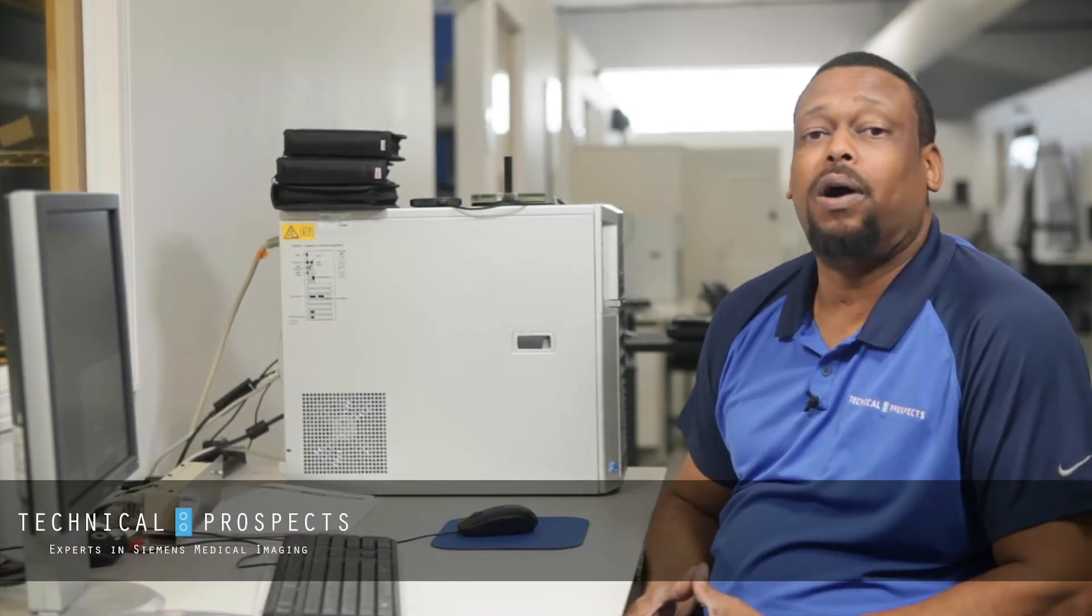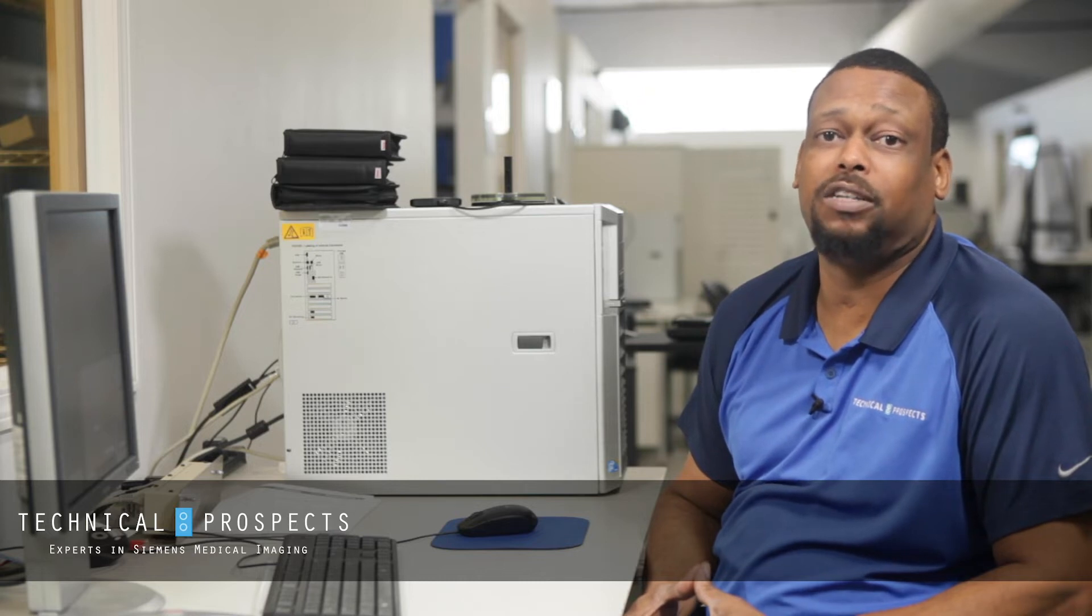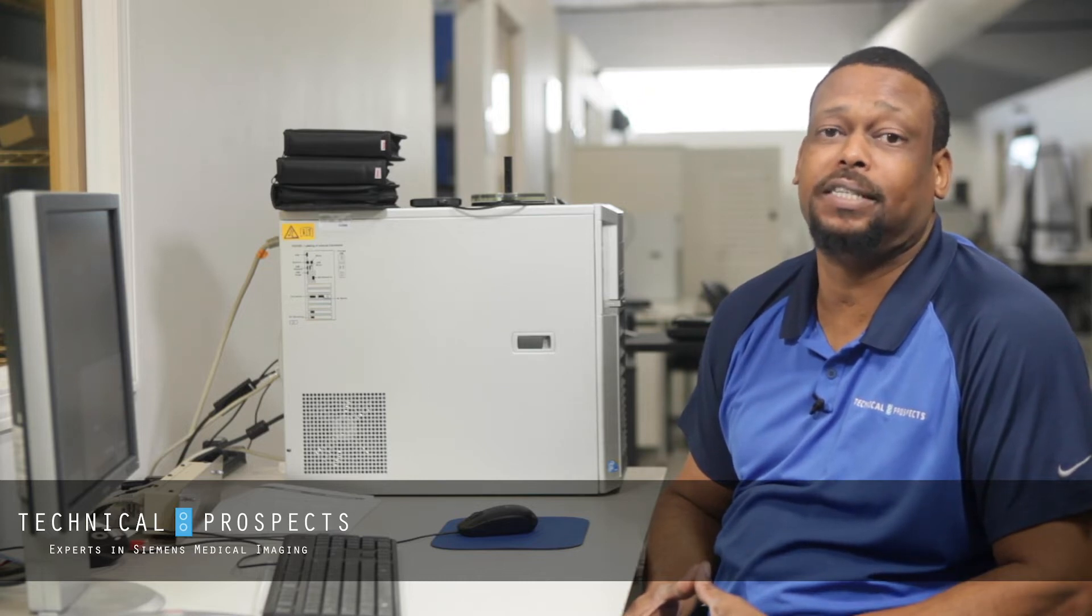Hi, this is Joe with Technical Prospects coming to you again with another Tech Tip. Today we'll be discussing how to access and save your files for your tube history on your CT system.